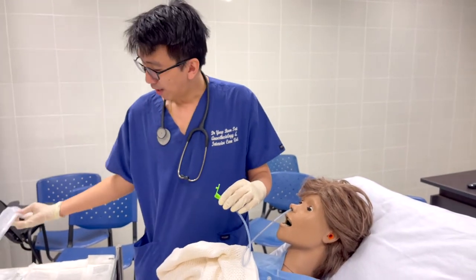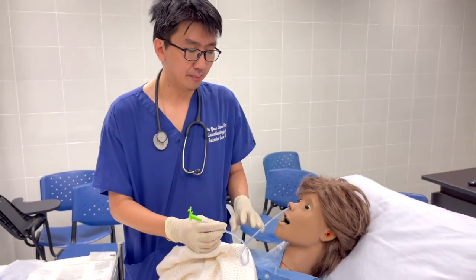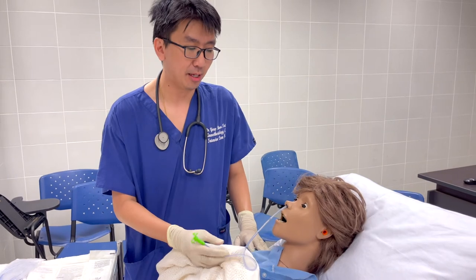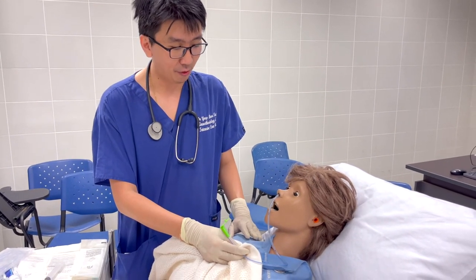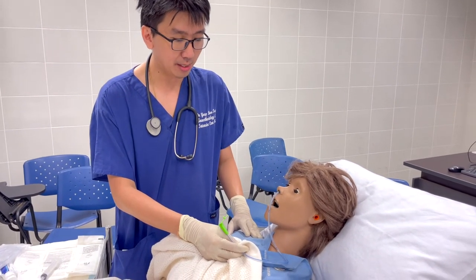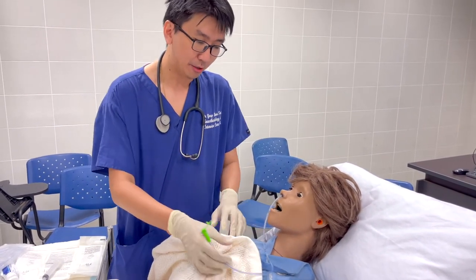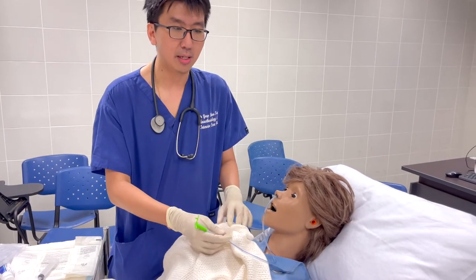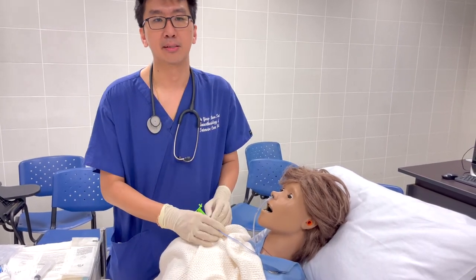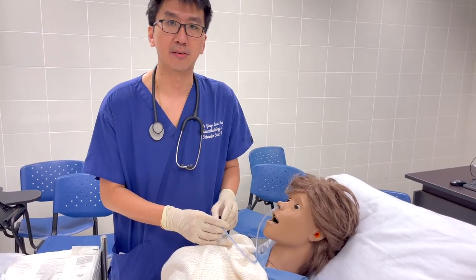After completing the procedure, please thank the patient: 'Thank you, Mrs. Elise, for your cooperation.' We then note the patient and complete the insertion of our Ryles tube.